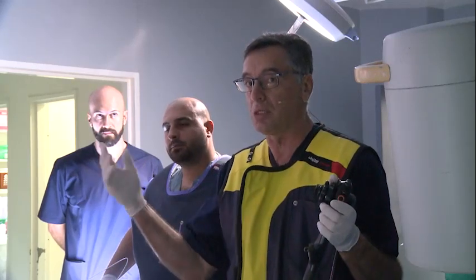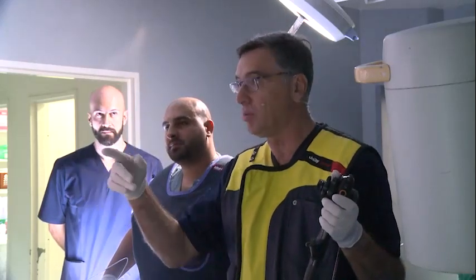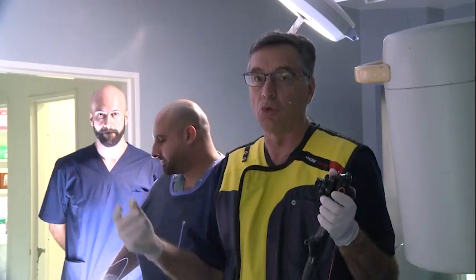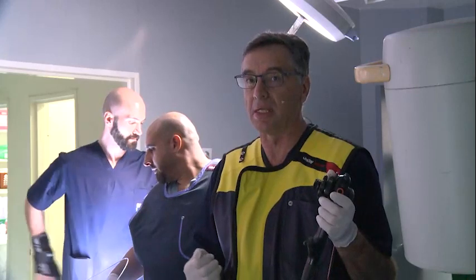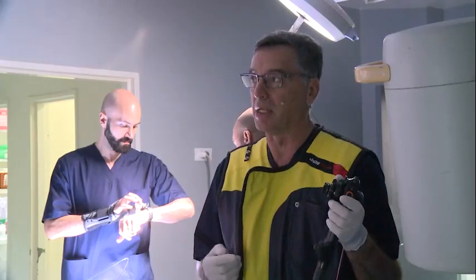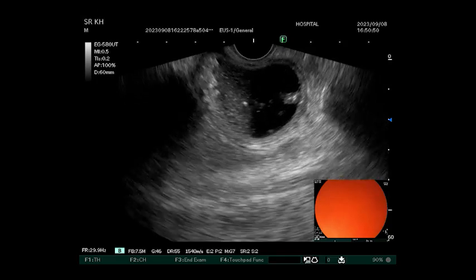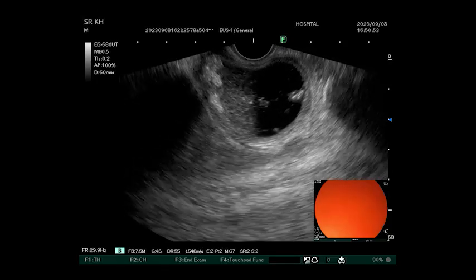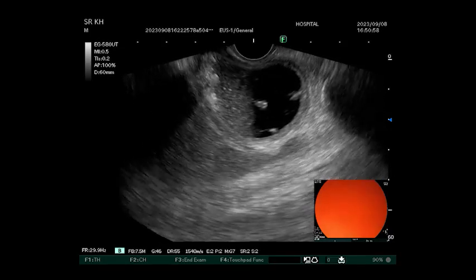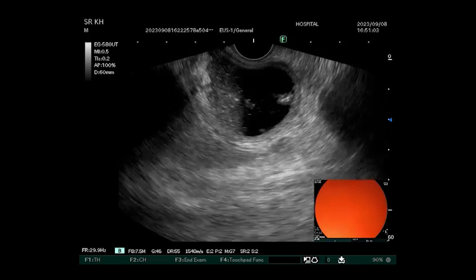We decided, as this patient already has a biliary stent, and I checked the bile duct, the CBD, with EUS. He has no more stones in the CBD, but he has, of course, some air due to the biliary sphincterotomy and the stent. He still has some symptoms due to his gallbladder. So you see the gallbladder, and the gallbladder wall is not so thick, so this is not a case of cholecystitis. This is a case of symptomatic gallbladder with gallstones after biliary sphincterotomy.